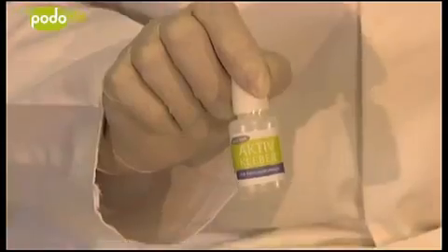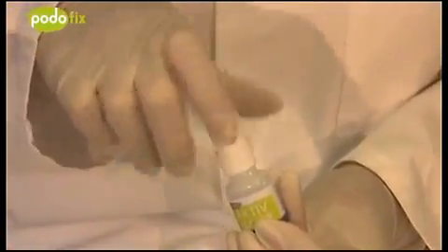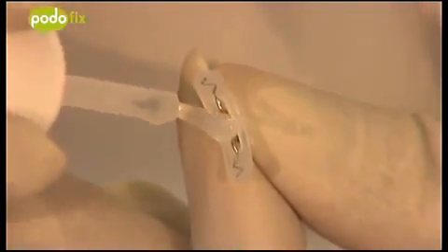The adhesive is now applied. Wipe the brush on both sides on the bottle edge and then moisten the entire brace underside with a thin layer of adhesive. Note that if too much adhesive is used, the brace will not adhere to the nail.